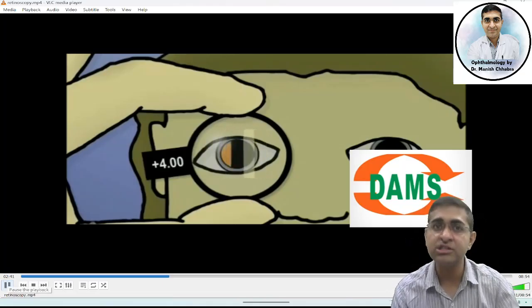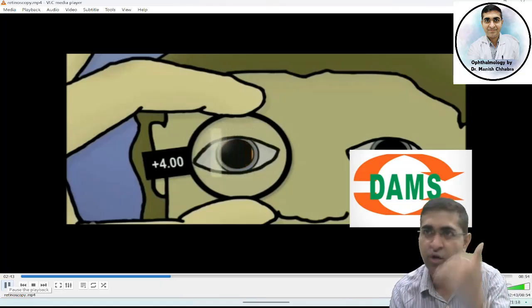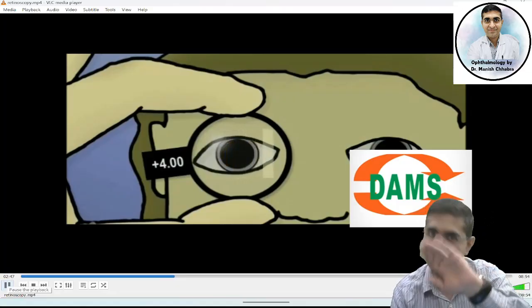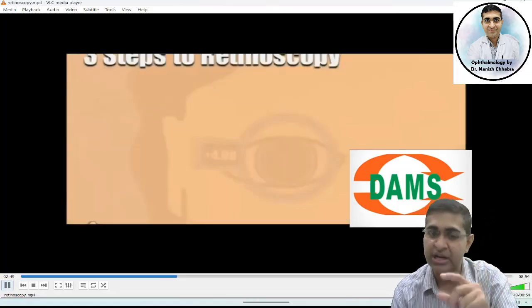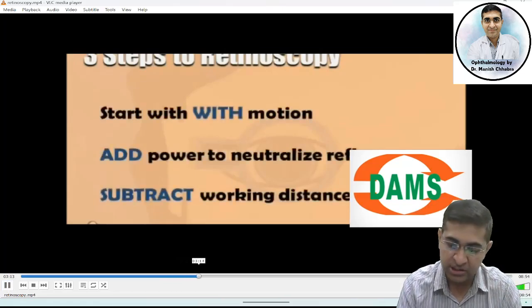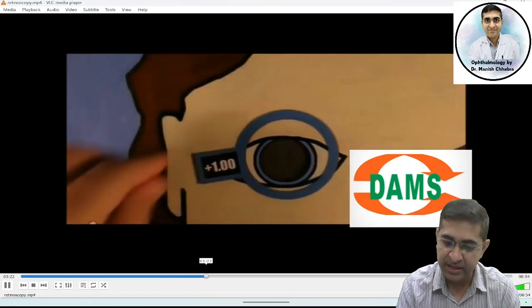Yes, don't simply start with 1 and directly jump over to 2, directly jump over to 3 and directly jump over to 4. No, you have to go slowly and steadily, 2, 2.25, 2.5 like this. Okay, so this is one thing. Okay, let's take another example.